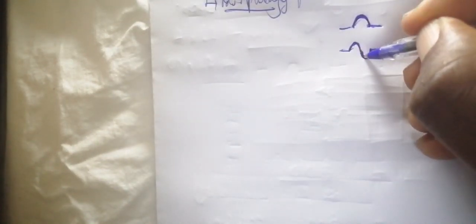So this is a normal P wave on limb lead 2, and this is a normal P wave on lead V1. On the lead V1, is it clear? So this is V1 and it is D2. D2 is the same as limb lead 2, this is the atrial. So that is the morphology. That is the main element.